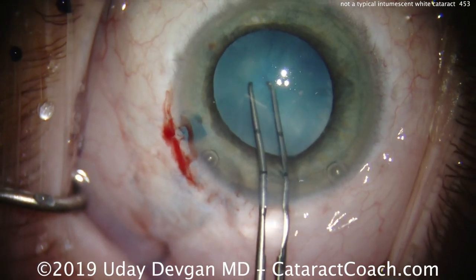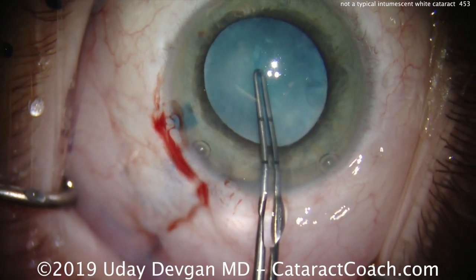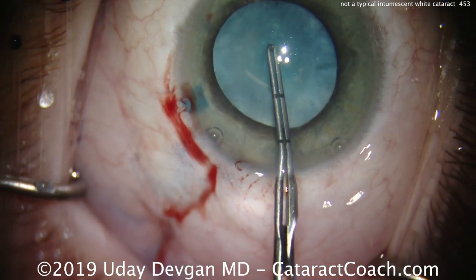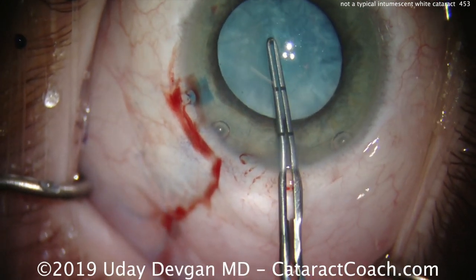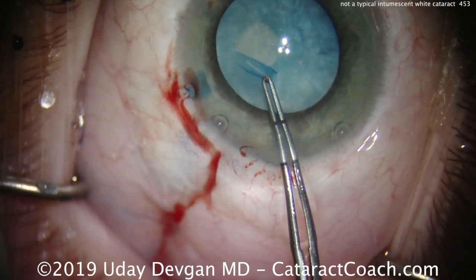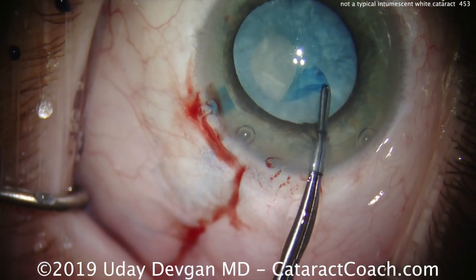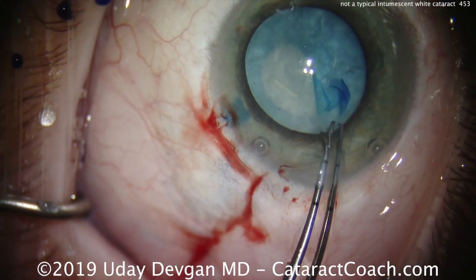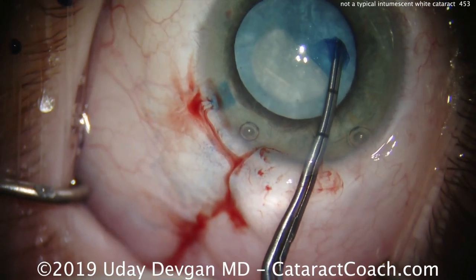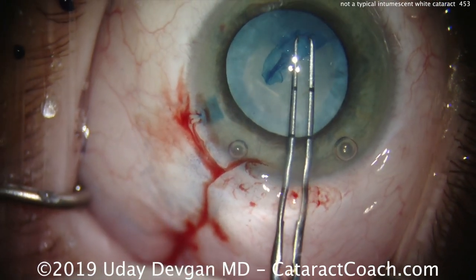So making the incision here, when we poke in the capsule already, it's not normal. I try to poke in, it's actually quite difficult to poke into it. We finally get it started. Now it's not because of zonules, zonules are fine. We start our rexis here and notice there's no fluid coming up. So that's a good giveaway. Another thing is the anterior lens capsule is not dome shaped. It's sunken in a little bit. So again, the key is the history. The patient had a vitrectomy just about a month prior.